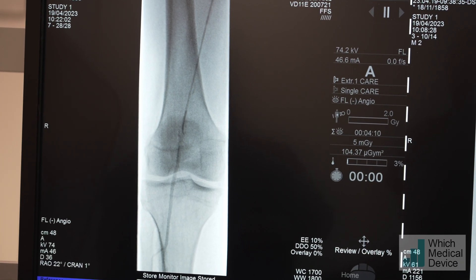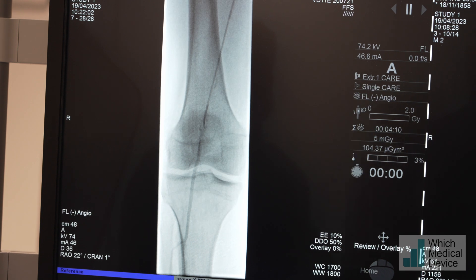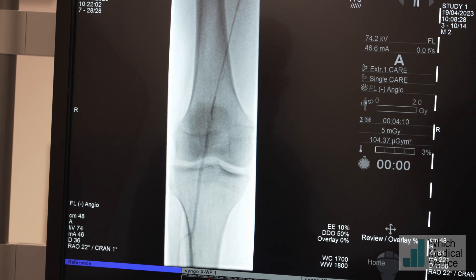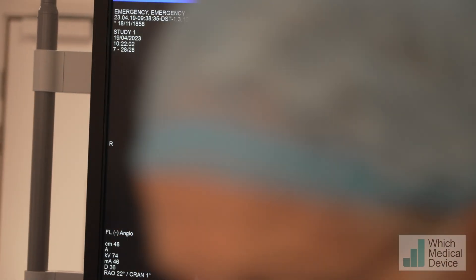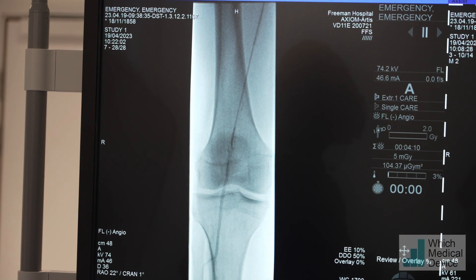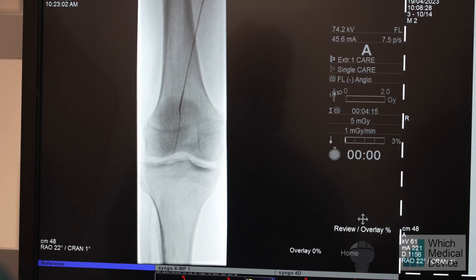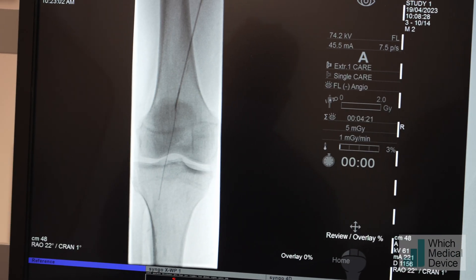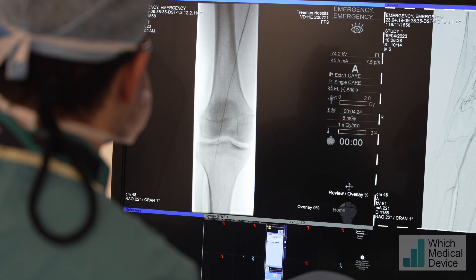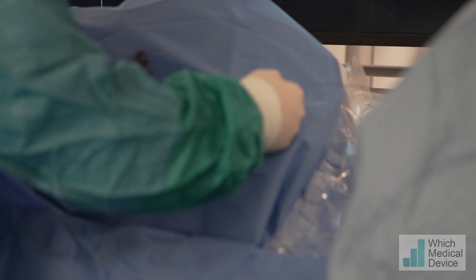That means we are intraluminal - we're injecting a little bit confirming we're definitely luminal. We'll now use the J wire. Is it long enough to exchange? Probably not. Shall we use a 180cm Benson? Can we get a white 180 Benson please? I'm placing the wire - it has a very floppy tip - around the top of the tibials. I don't really want to go into the tibials at all if possible. The wire tip should be distal to the occlusion. Catheter out and balloon in place.